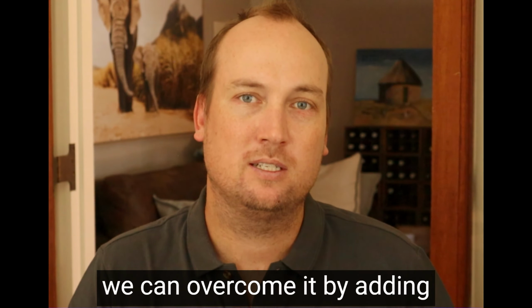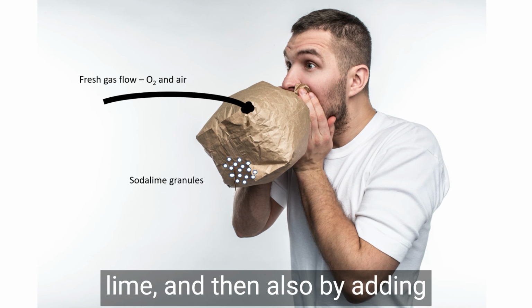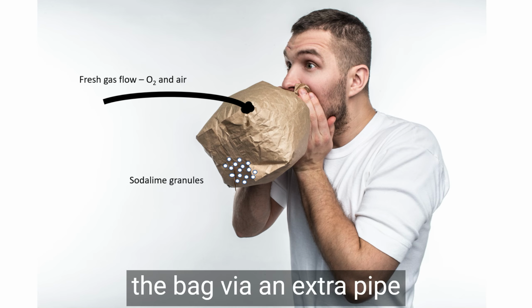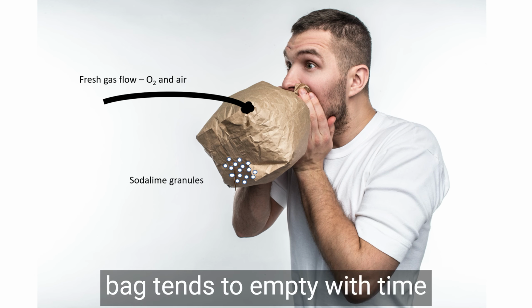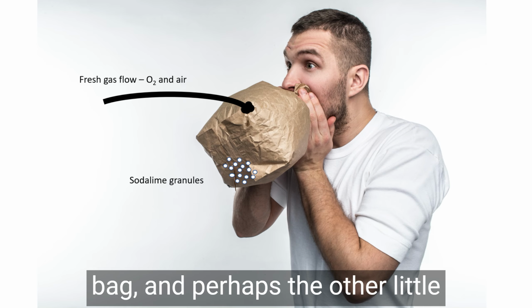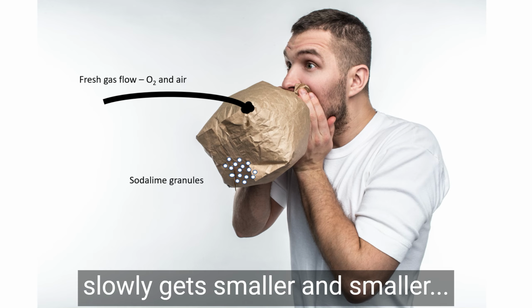And we can overcome it by adding some carbon dioxide absorbent granules that are called soda lime, and then also by adding a trickle of extra oxygen to the bag via an extra pipe coming in from the side. The other problem is that the bag tends to empty with time because of leaks around the join between the mouth and the bag, and perhaps there are other little tears in the bag, and so there are constant leaks from the bag, and it slowly gets smaller and smaller.